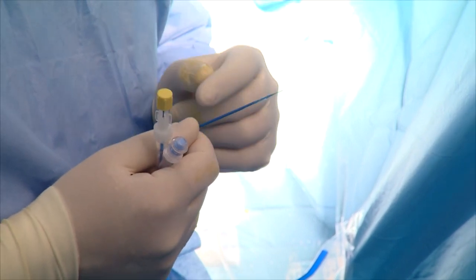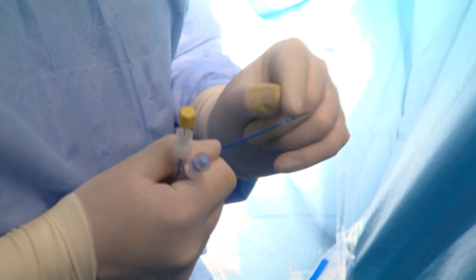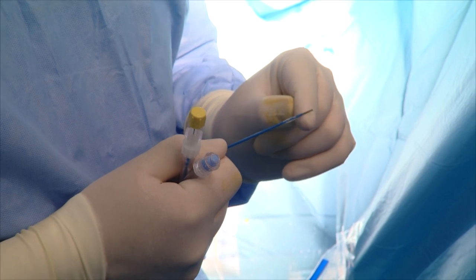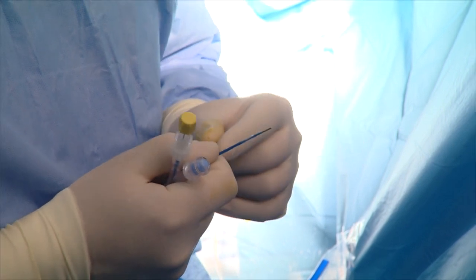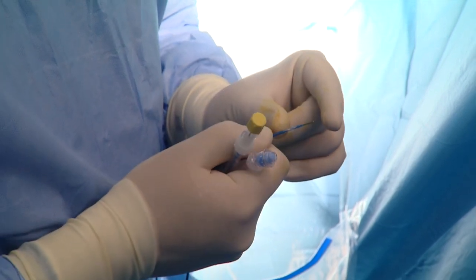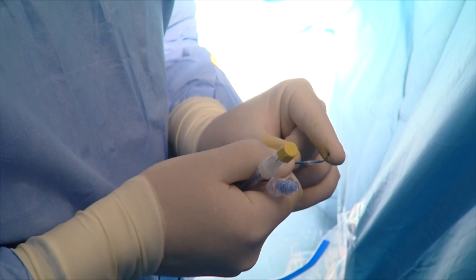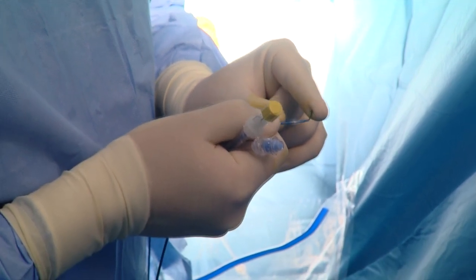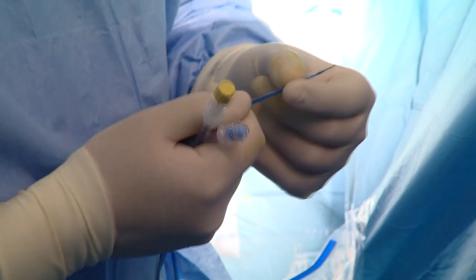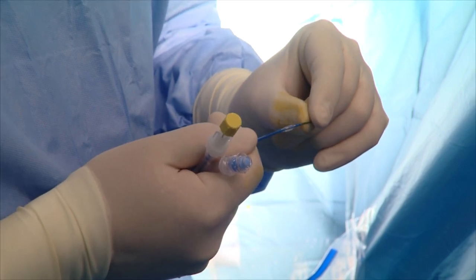The second feature of this balloon catheter is that there are 10 millimeters more guide wire at the tip of the catheter. And this facilitates the insertion of the balloon catheter. Let's have a look. You are approaching the ureteral orifice, and the tip of the guide wire is flexible, which means you have only one step. Not the rigid ureteral catheter, but a small tip of this special guide wire.